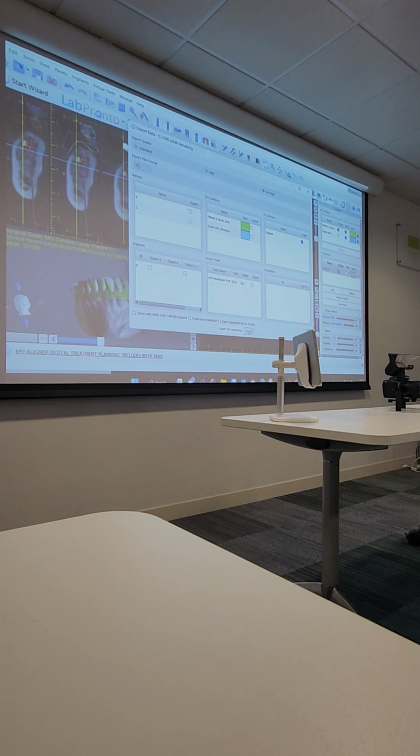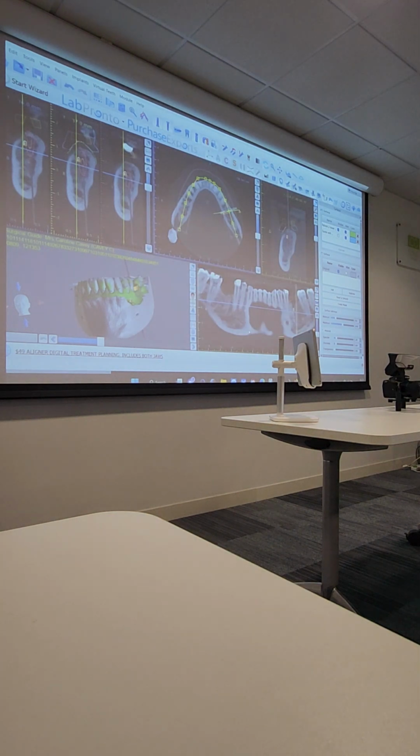Do some interesting things with that. Like I said, it's very comprehensive. It's got ortho modules and you know you can use it as a CAD software as well. So it replaces your in-lab software or ExoCAD software. It's really powerful software. But again, use whatever you want to use.